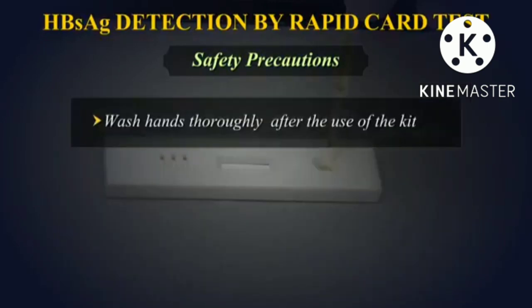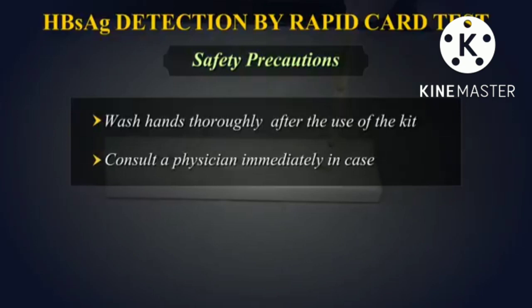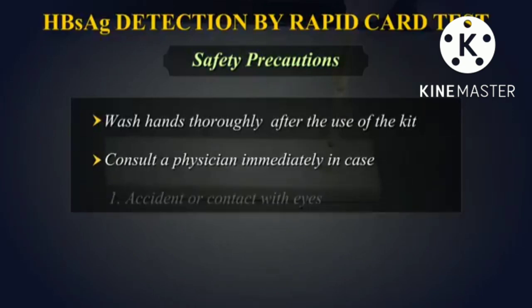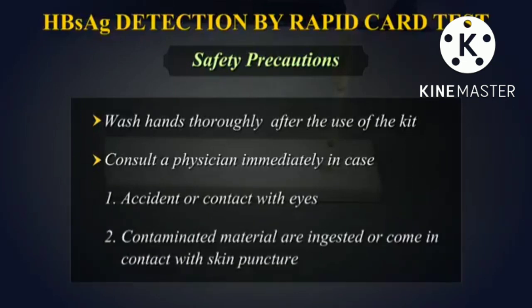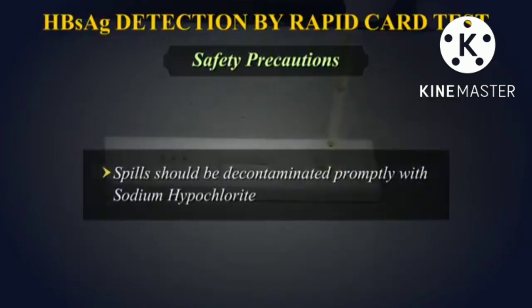Wash hands thoroughly with soap or any suitable detergent after the use of the kit. Consult a physician immediately in case of accident or contact with eyes, or if contaminated material are ingested or come in contact with skin puncture or wounds. Spills should be decontaminated promptly with sodium hypochlorite or any other suitable disinfectant.